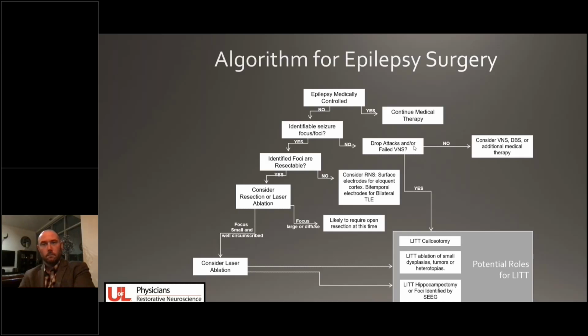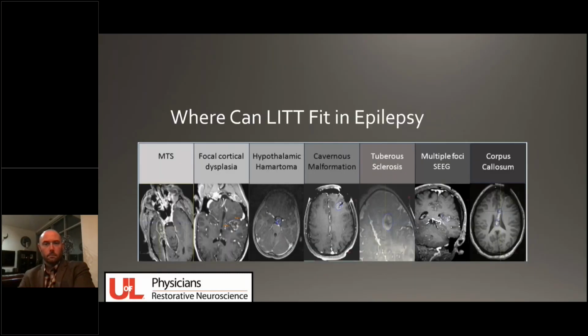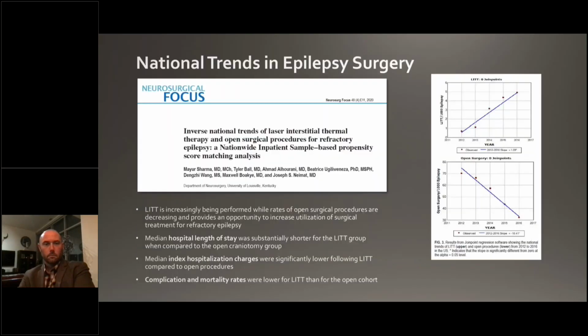So my algorithm in essence is, if that first ablation does not work, typically to perform stereo EEG, and confirm whether or not the remaining seizures are coming from the same temporal lobe. If they appear to be substantially coming from the other side, then you're talking about RNS. If they're coming from the side that you treated, typically then I would do a temporal lobectomy. I've got a few more slides here which I can go through quickly and then answer any more questions.